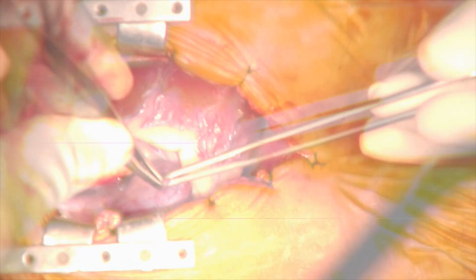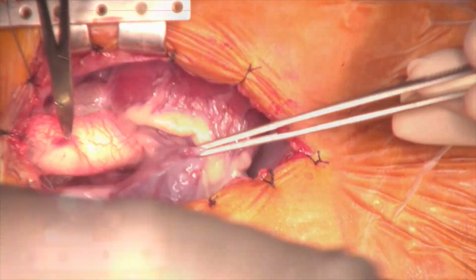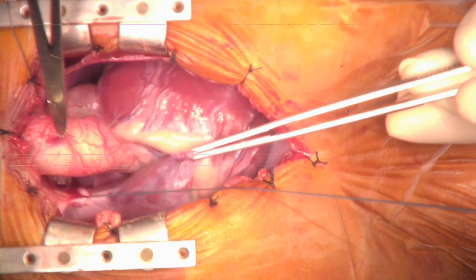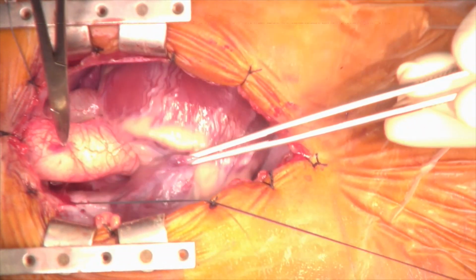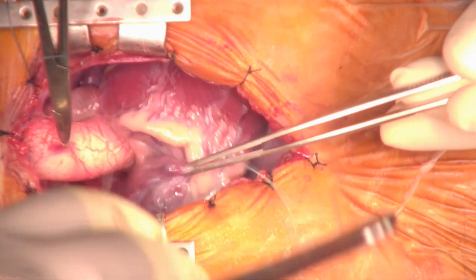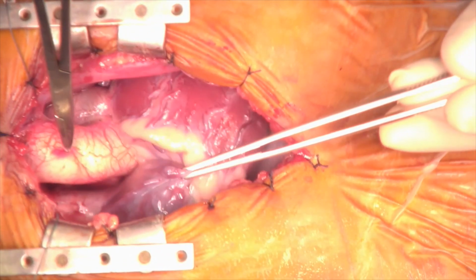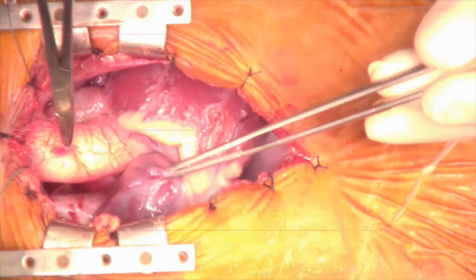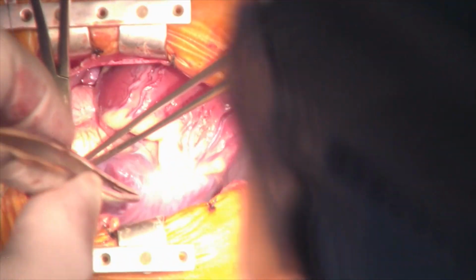The right atrial appendage is drawn downwards to expose the cannulation site on the superior vena cava. A purse-string suture is placed around the intended site of cannulation, just below the level of the superior caval snare. The drainage cannula for the superior vena cava will be placed through the purse string.